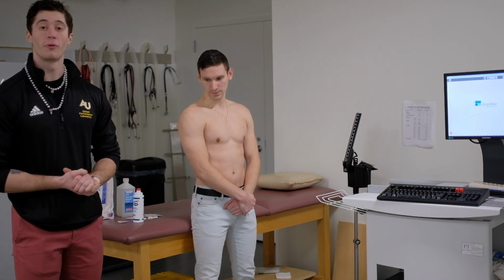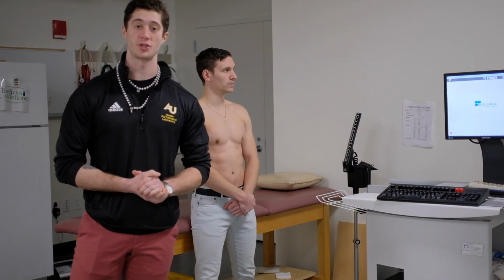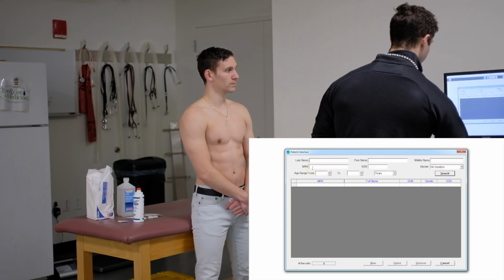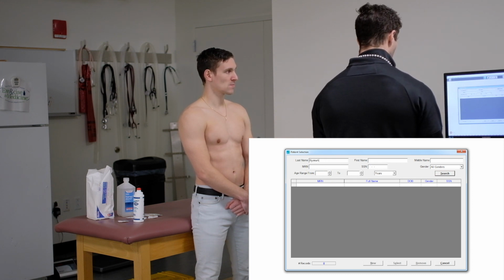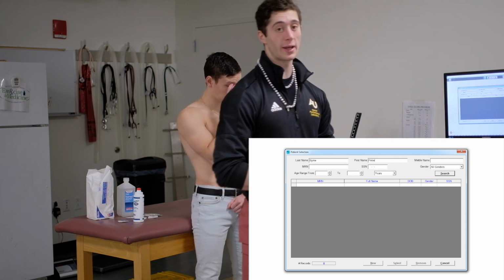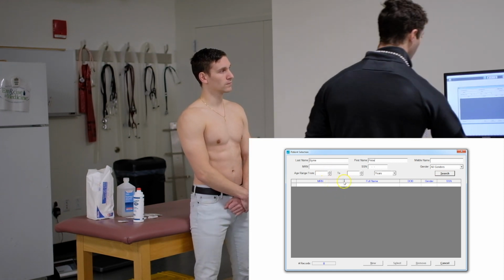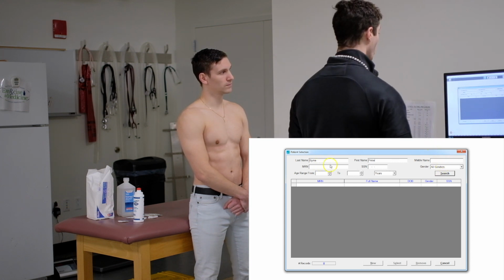So, before we start the test, what we can do is input the information of our subject in the computer. So we'll come over here to the computer, and we'll go ahead and input that. First, we have the last name, that's Byrne. First name, Peter. Now, if they were already in the system, we could then hit search and they would pop up in the box below. However, Peter's never done a test on this system before, so we have to input his information.